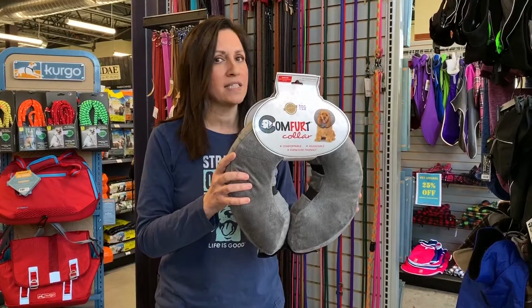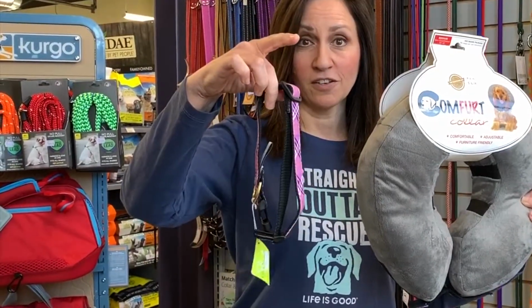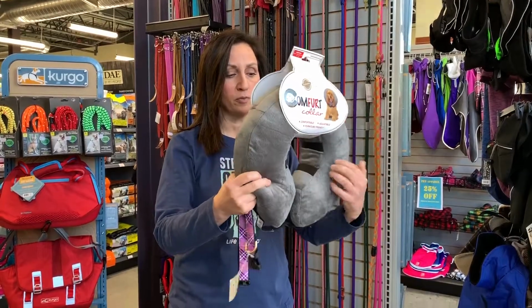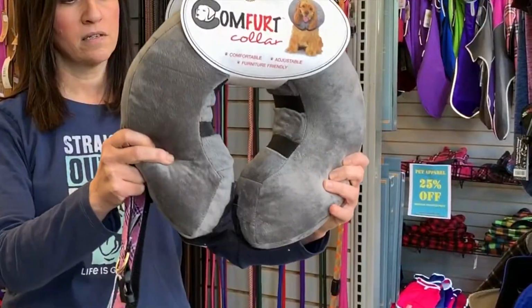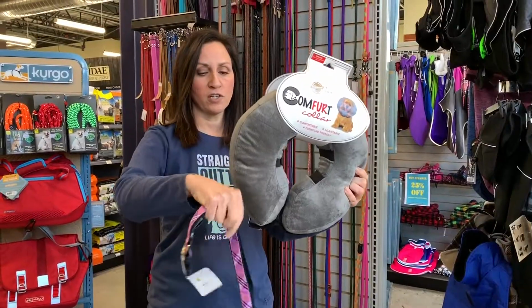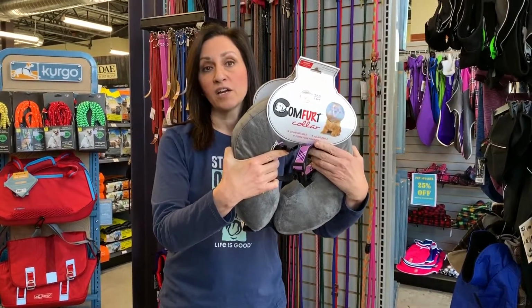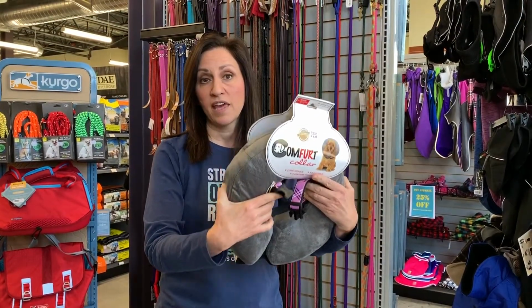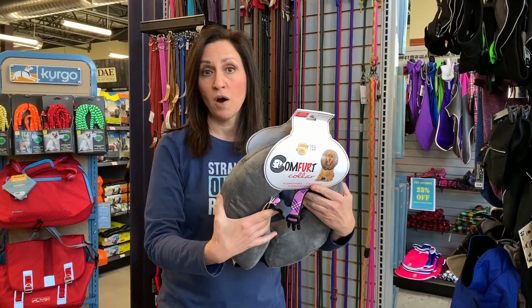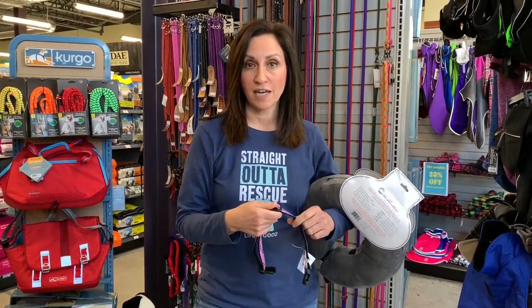This alone is not enough. You need one of these. Another collar. Why? Because there are loops on the insides here. Can you see those loops? The collar is actually going to get threaded through the loops so that this thing stays on your dog's neck. They can paw at it and it won't come off if this is sized correctly. Big mistake that people make. They use the same collar that they take their dog outside with.